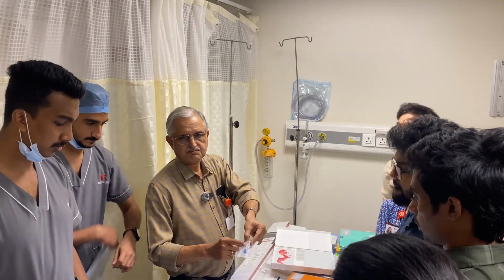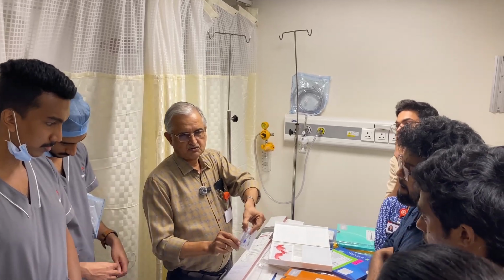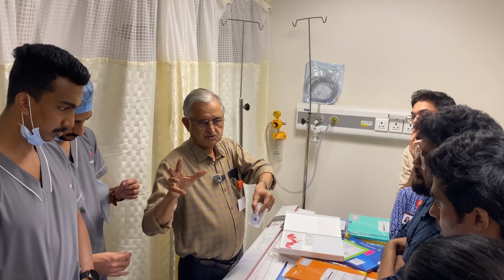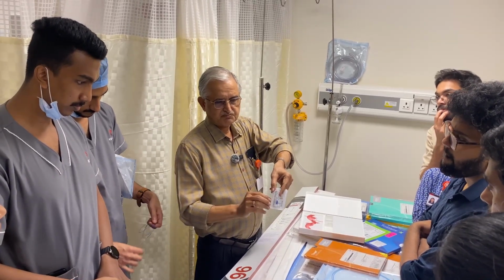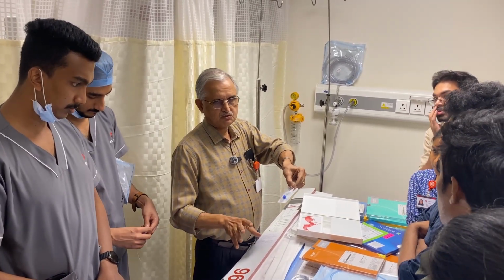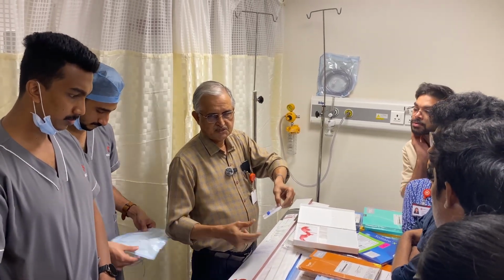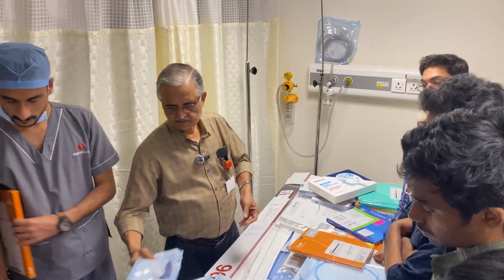This will prevent backflow. Suppose if the infusion is not going on with the pressure, because it is into the arterial system, so the infusion pressure has to be above arterial pressure. Sometimes if the infusion pressure is low, there is a chance that the blood and other things will come back into the system, which is not good. So sometimes they will use a valve-like thing in between. This is that valve.